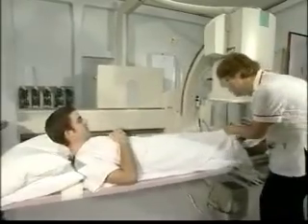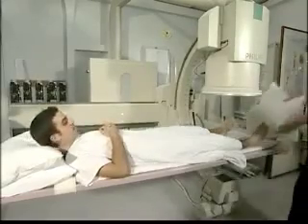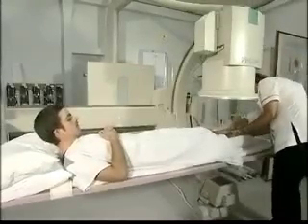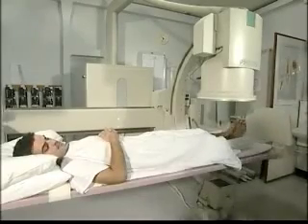A fluoroscopy system is used. This consists of an x-ray source — in this case under the bed — and an image intensifier above. The image intensifier produces continuous digital images, which are displayed on a monitor and can also be recorded for later use.